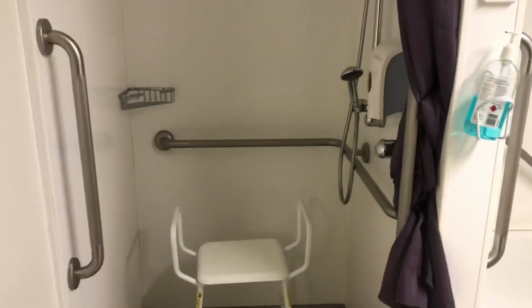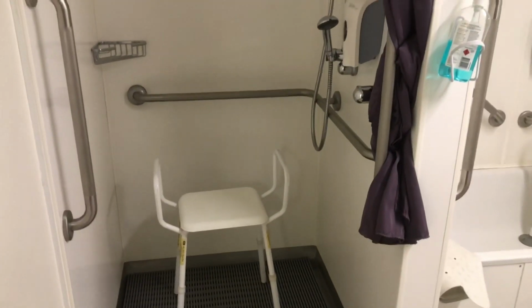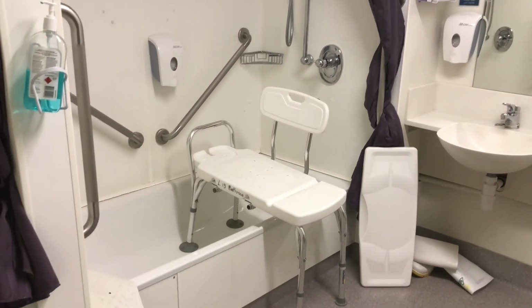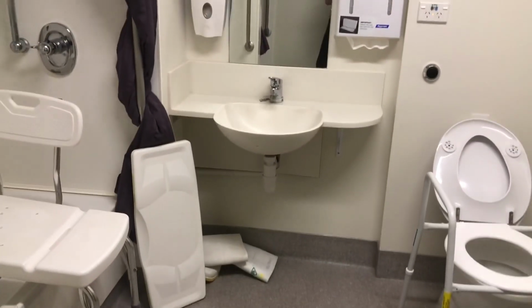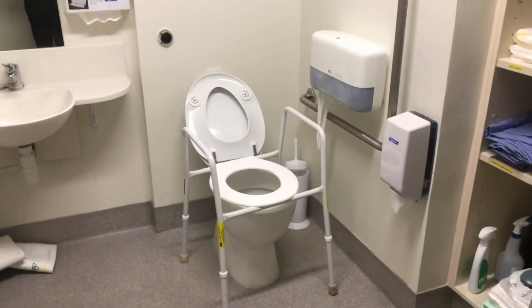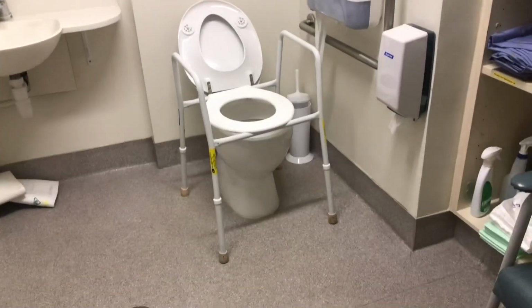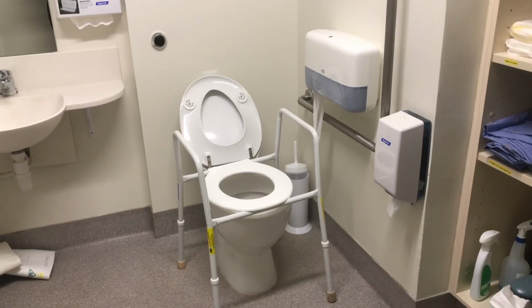These are commonly prescribed pieces of equipment such as a shower stool to manage fatigue and to manage pain when showering, and transfer bench to aid safer transfers in and out of the bath because it's a time of high falls risk. We've got a bath bench on the side here, a bath board, sorry, and over toilet frame, which is one of our most commonly prescribed pieces of equipment. It has height adjustable legs and it has 2 handles that the patient can push up from.